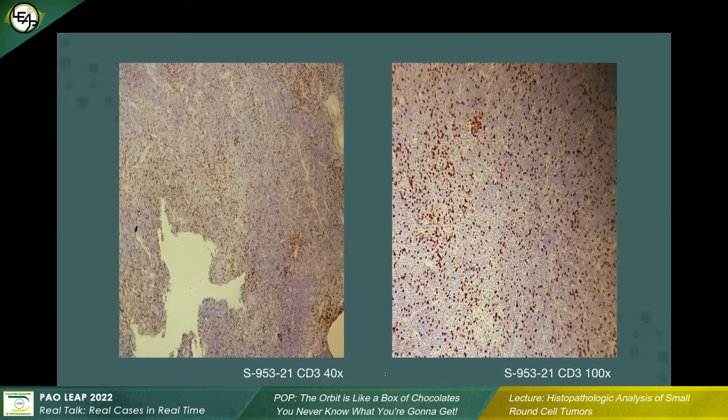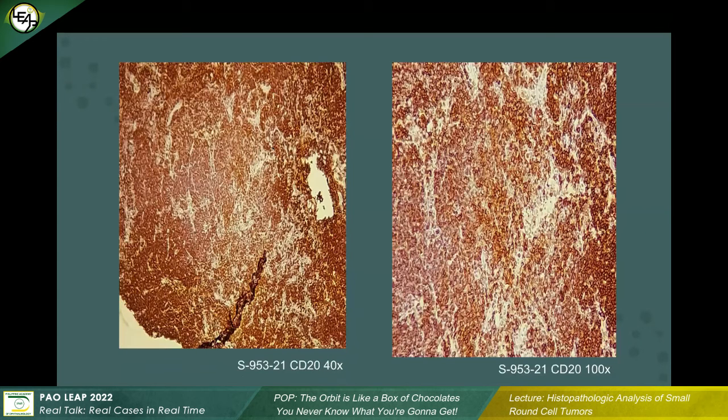And so the last immunostain that was requested was CD20. And you can see that it is heavily stained. There's a very high expressivity of CD20 on the tumor cells that are under investigation. So we can say that this is a positive CD20 stain. Okay, so they actually indicate a high expressivity of monoclonal B cells, right?